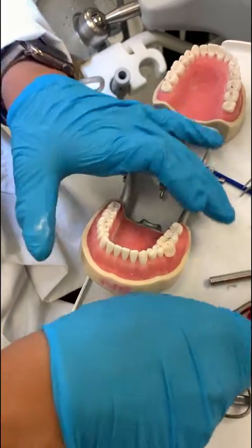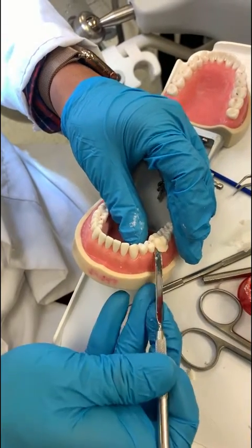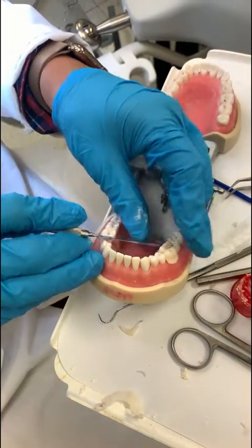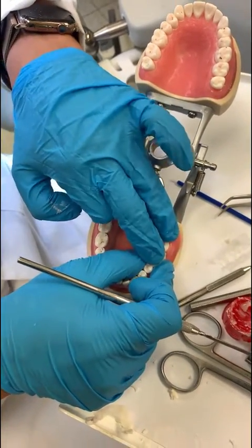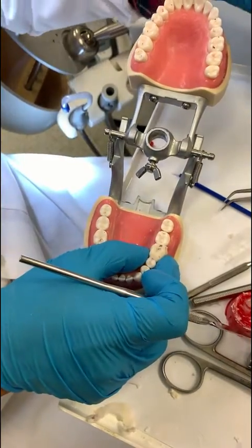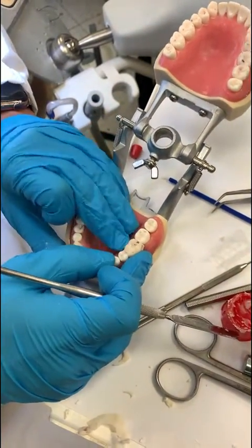When it gets to the point, I'm going to lift this one up again, put it back in, and lift it up. If there are any undercuts it's going to get cut out. If I leave it there to set it's going to engage the undercuts — no good. The acrylic sets pretty fast, so it's going to set really quick.